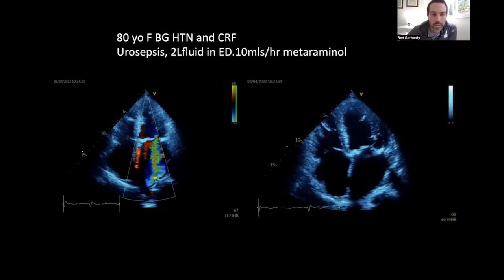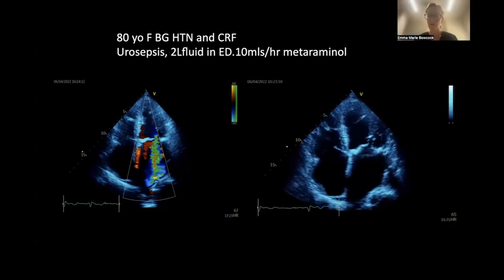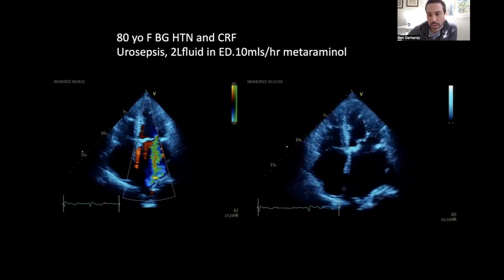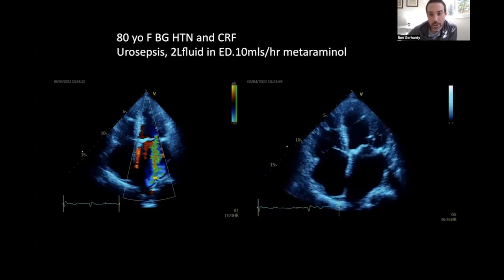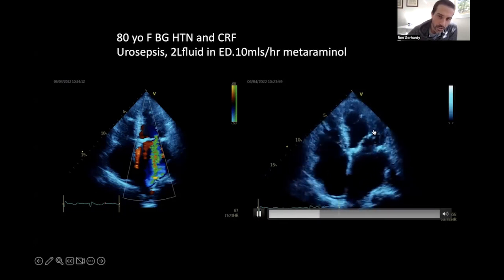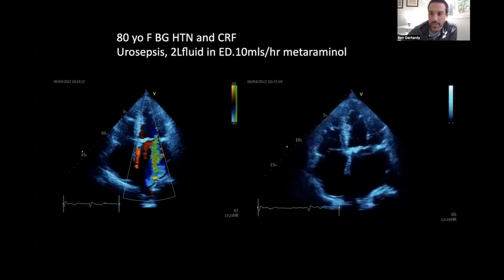One is annular dilation, so left atrial functional mitral regurgitation with a dilated atrium. She's in atrial fibrillation, isn't she? Yeah, okay. So atrial fibrillation is a potential contributor to that, or a main cause of that. Given that she's got severe renal disease and some hypertension, left ventricular hypertrophy, there may be some myocardial ischemia in her past with an ischemic insult to the posterior leaflet giving some tethering there. But given the zone of apposition or coaptation of the mitral valve looks to be more towards the posterior side, I think that she's got a dilated annulus.